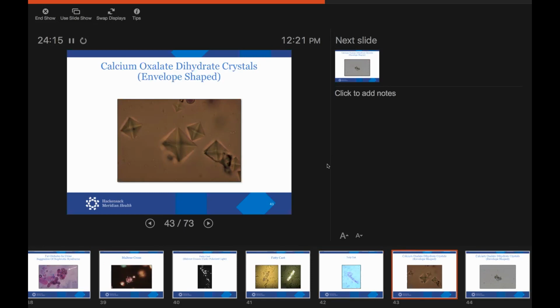You'd see a whole different approach in hospitals that really spend a lot of quality emphasis on urine analysis reporting. It's nothing like you see in our labs here. And I would say there's no hospital in New York that I've seen either, by the way. The other issue is you have to also know that a red cell cast is such an emergency that in real labs they have to be double reported. In other words, it has to be confirmed by 2 people who only look at urines all day long. There's actually a special way to look at urines, and also reporting out urines.